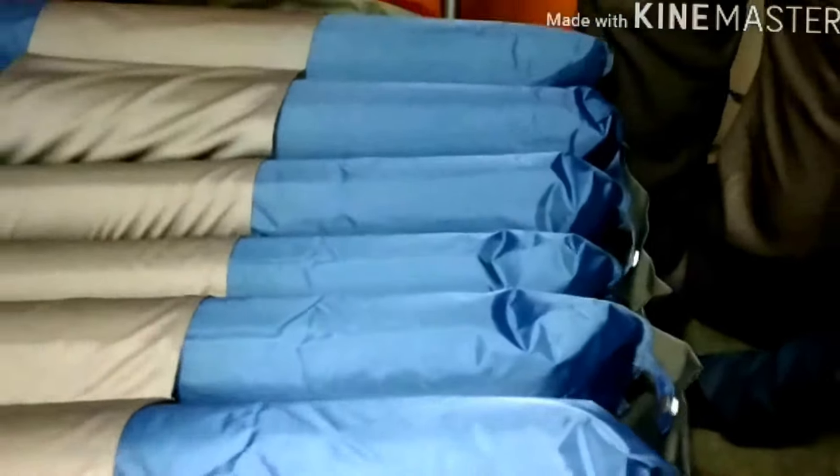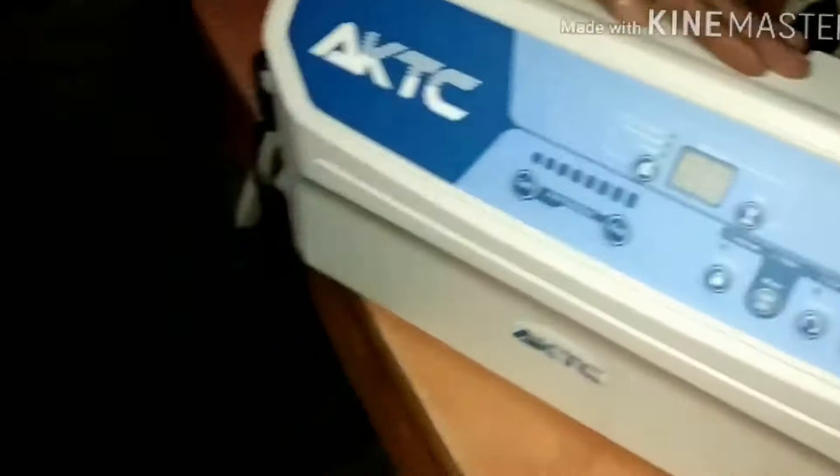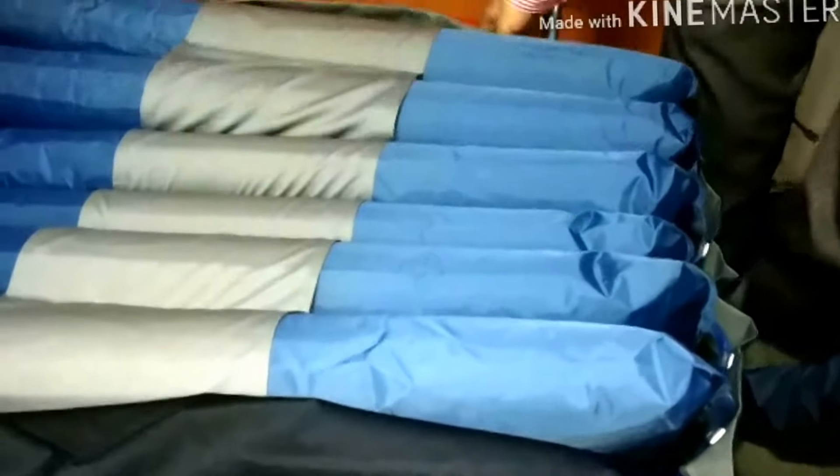This air mattress basically has two parts. One is the machine and the second one is the actual air mattress. Now coming to the air mattress first.